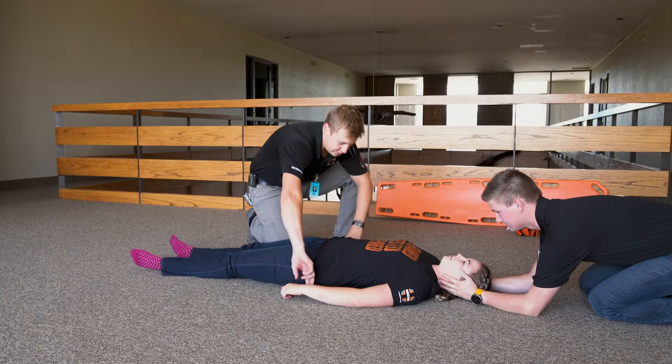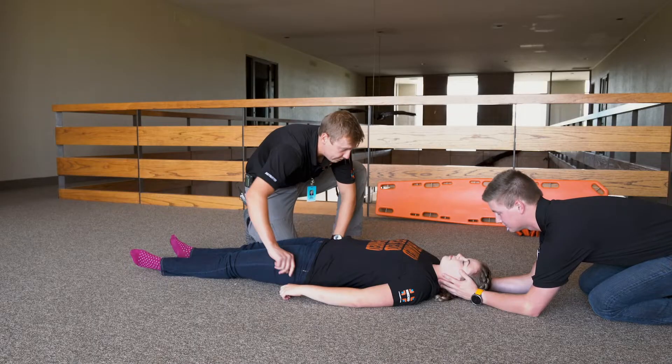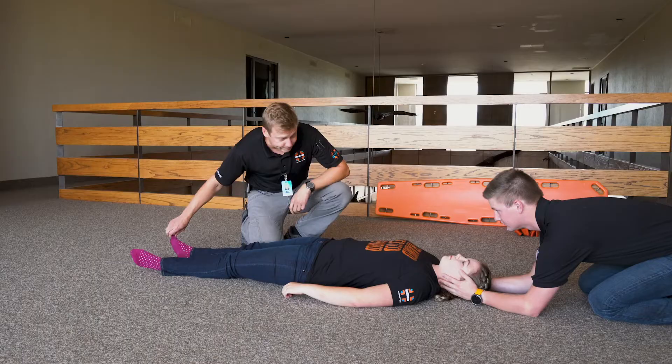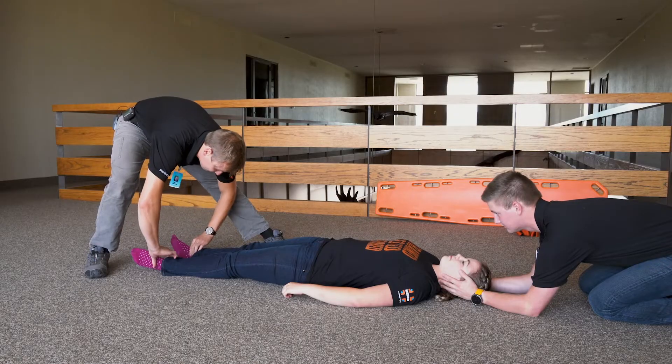Reassess the patient's distal circulation, sensation, and motion by checking pulses. What finger am I touching? Index. What finger? Thumb. Squeeze both. What toe am I touching? Big toe. What toe? Pinky. Wiggle them for me. Distal pulse is intact.